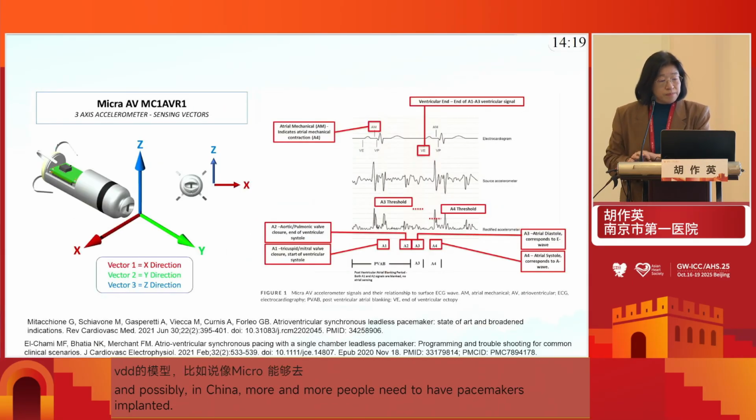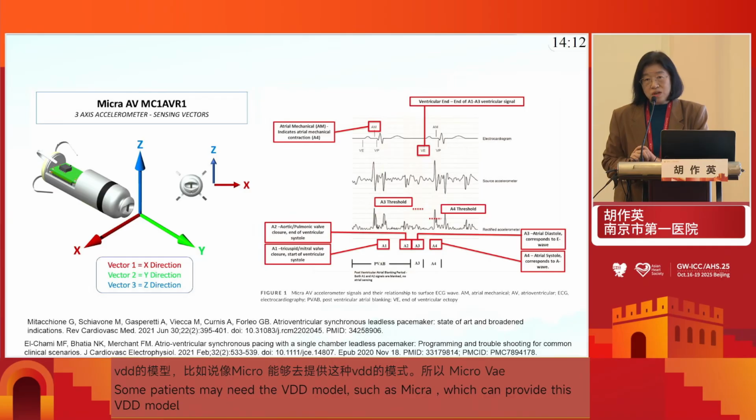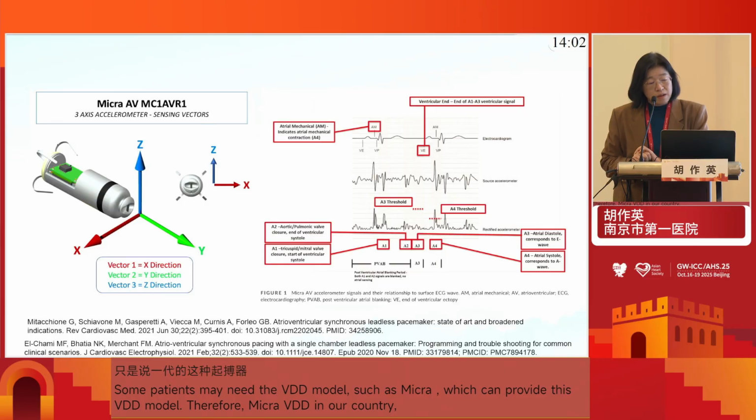The Micra AV in our country is just the first generation of the leadless pacemaker, and the second generation will come soon, but they have similar mechanisms.